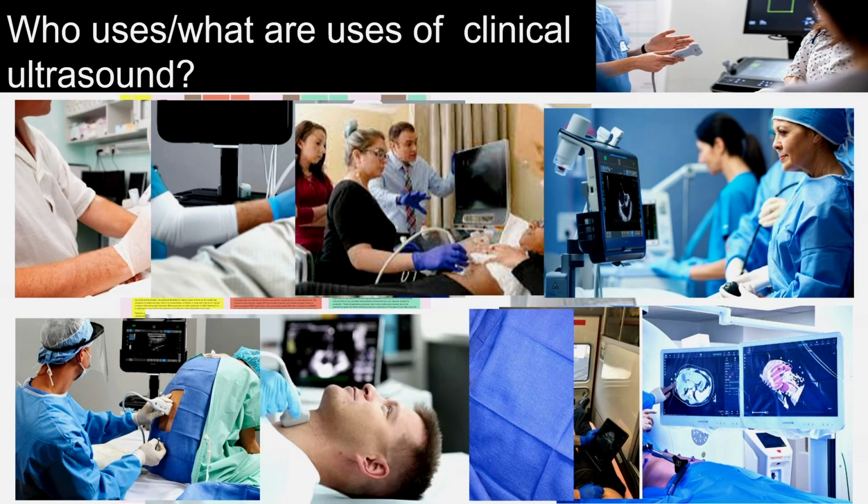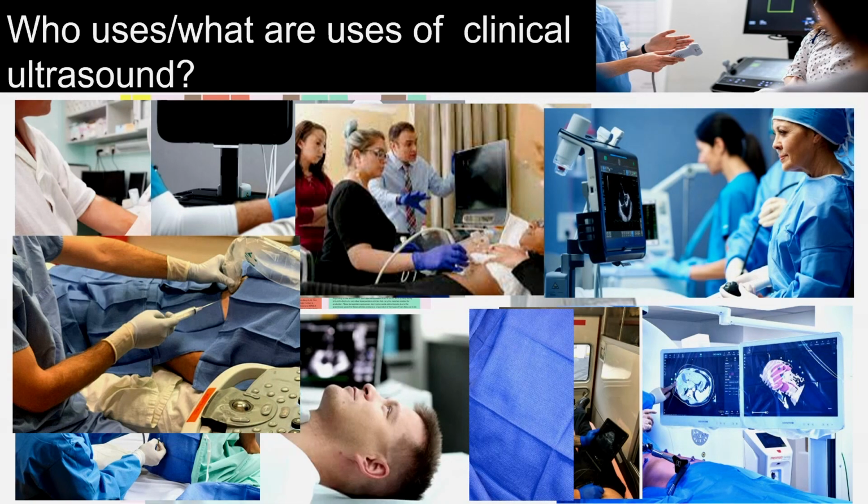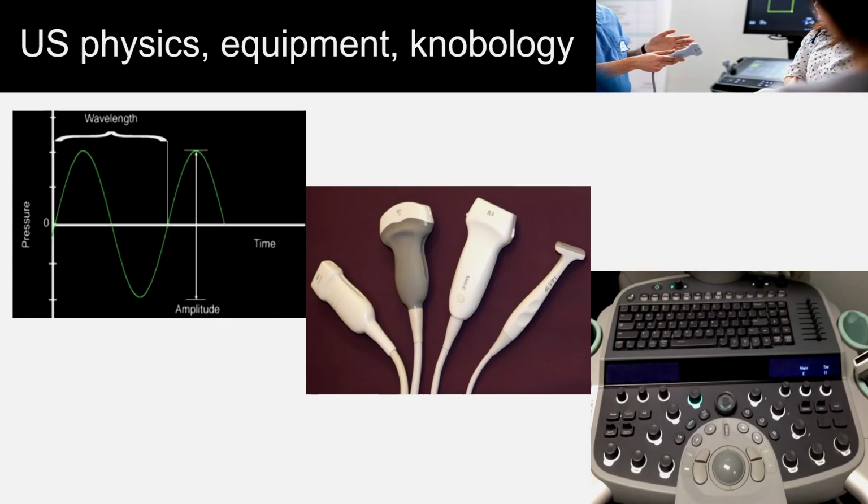Perhaps my anesthesia colleagues use it for epidural pain injection or for pain control in the MSK setting by their team. Or perhaps my emergency medicine colleague uses it not only to do a quick assessment in a critically ill trauma patient, but to potentially do a pericardiocentesis as shown here. So a vast number of uses, a vast number of settings.